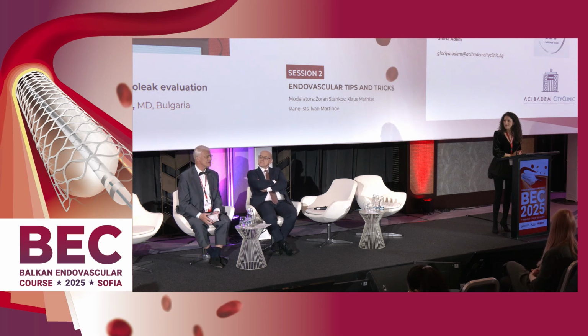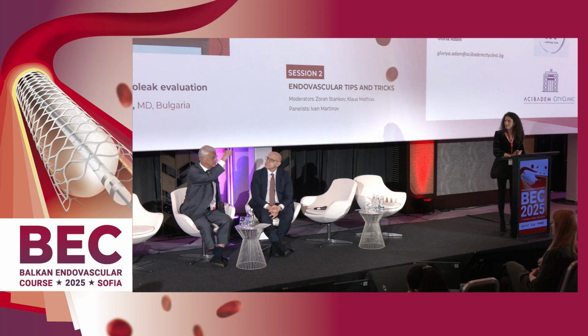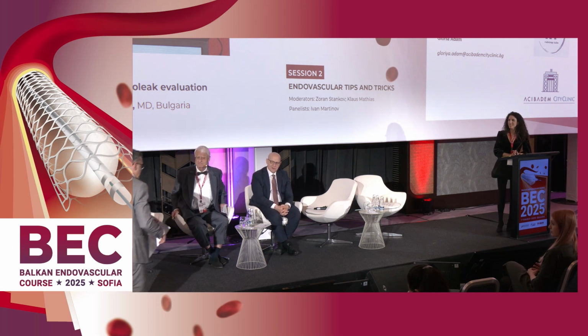Mm-hmm. A tip. Yes, it must be at least, otherwise you cannot puncture it. Yes, but under CT guidance, it worked well. Mm-hmm. So, there is another question or comment.